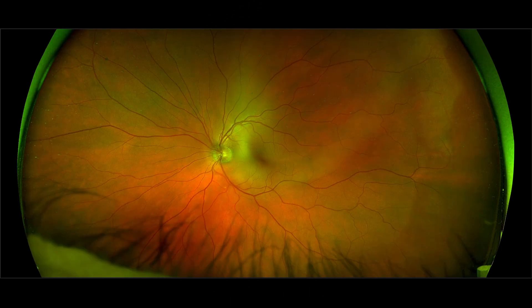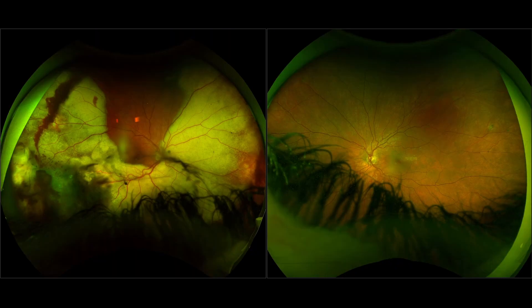The next benchmark is Optos. Optos is SLO but non-confocal, so you see everything in front — eyelashes, eyelids, floaters — and the images are slightly distorted. Quality is not as good as Adon. Particularly for fluorescein angiography, the macula and optic nerve are not depicted evenly, making it not optimal for AMD or other posterior pole problems.